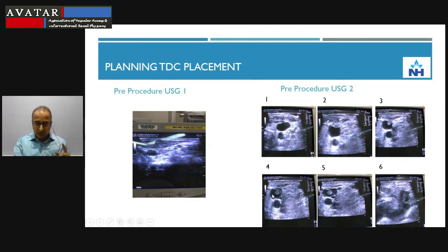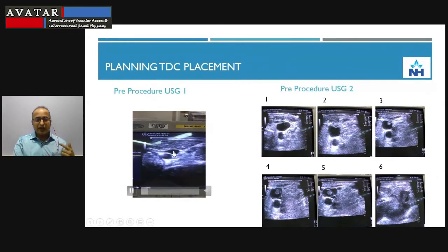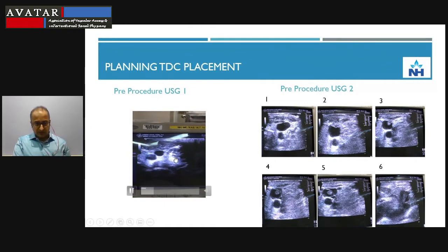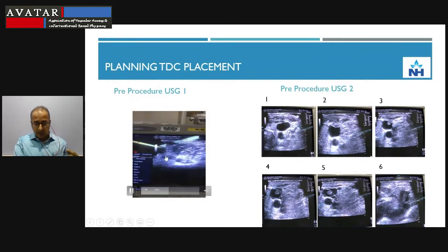So in this person, you can do the catheter in a dedicated procedure room, without the help of a C-arm. However, on the left-hand side, I've got this video where you can see the vein is compressible, which is a very important sign that the vein is not completely occluded. We are going from top to the bottom of the neck. You can see the pedunculated mass coming somewhere there now. There you go. And the vein is as small as the artery, which is not very good. It's a very small caliber, and most of it is occluded with that pedunculated mass. So not much space is left.